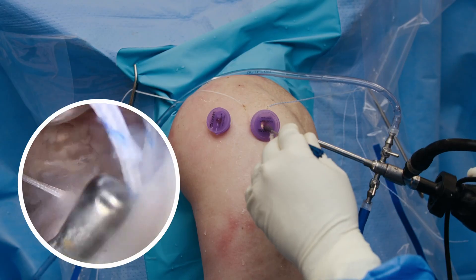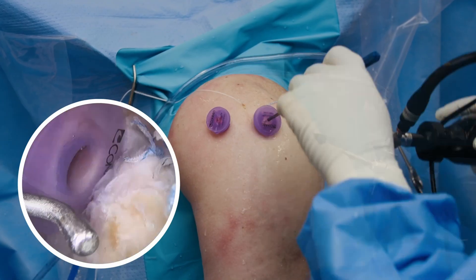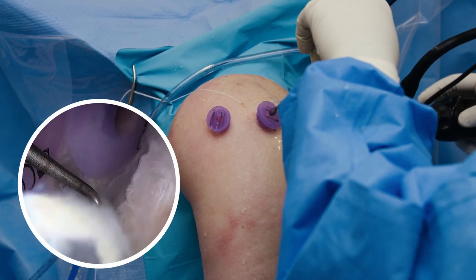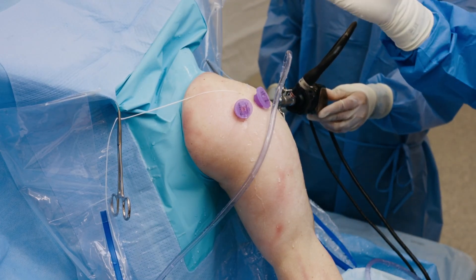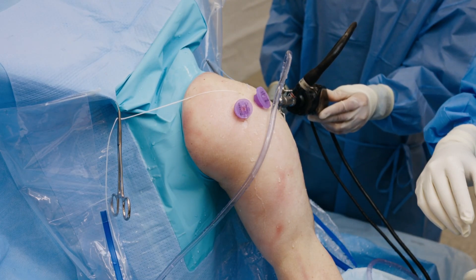Now I'm inspecting the shoulder to make sure that we have excellent exposure for the biobrace placement. Now that we have an excellent single row rotator cuff repair and our sutures are appropriately placed for the biobrace RC device.